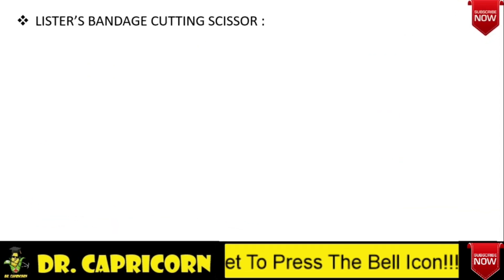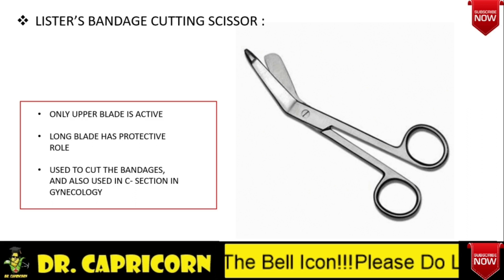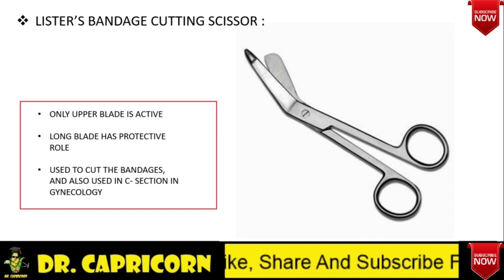Lister's bandage cutting scissor. There are two kinds of blades: one is short, which is active and used for cutting purpose, while the other is a long blade and has a protective roll. This blade is used for cutting bandages, and it is also used during caesarean sections.